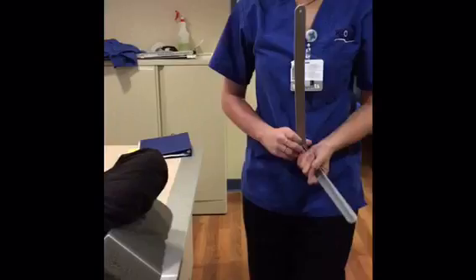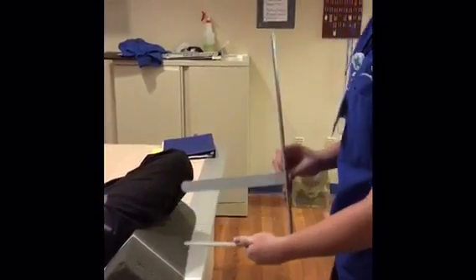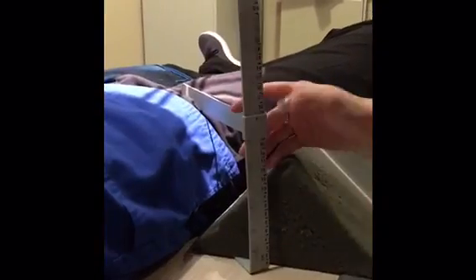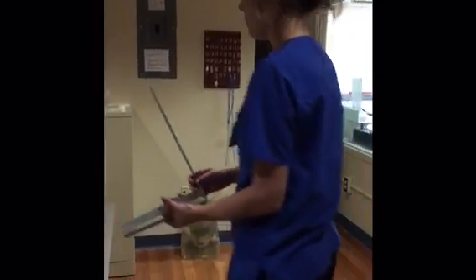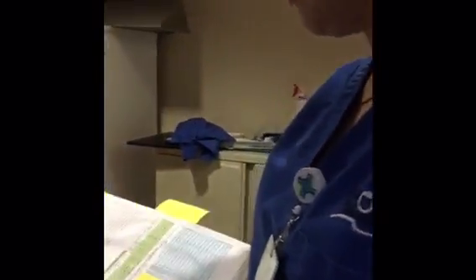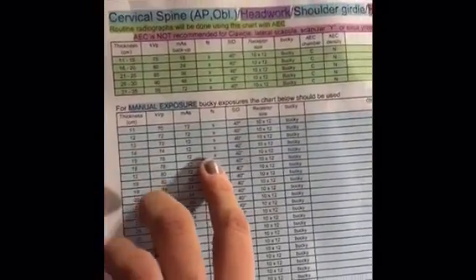Measuring is going to be a little different. Because she is set up on a sponge, we will have a little bit of magnification, so I will need to include the sponge in my measuring. She again now will measure, instead of 16, she measures 15 centimeters. I will come over to my exposure chart. My new exposure factors are going to be 76 kVp at 12 mAs, again with a small focal spot for bony detail at 40-inch SID.